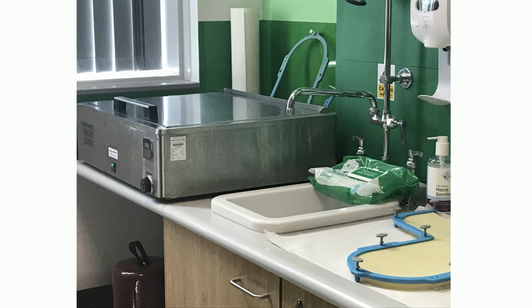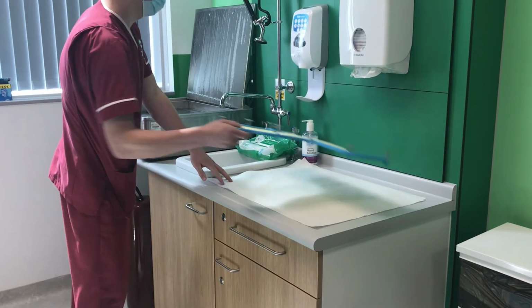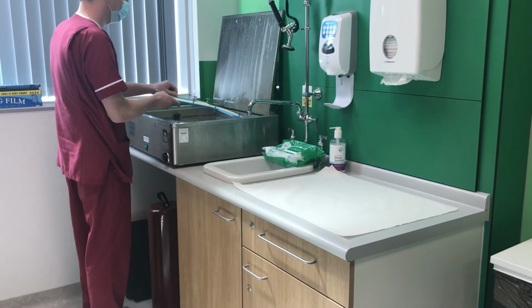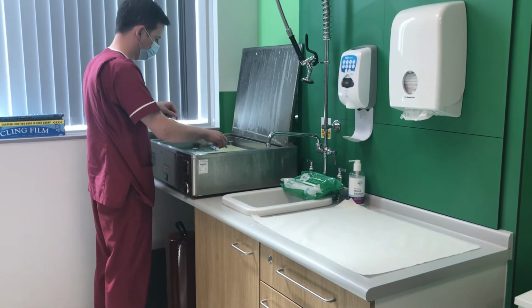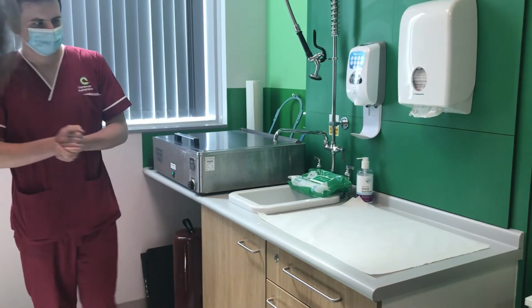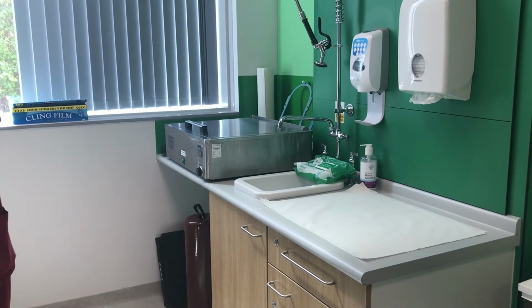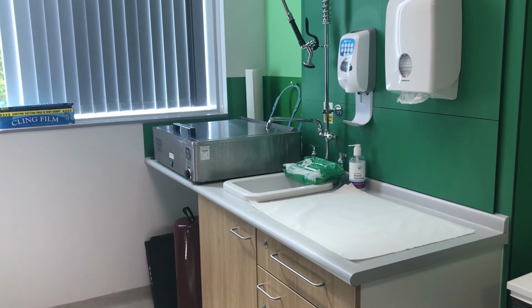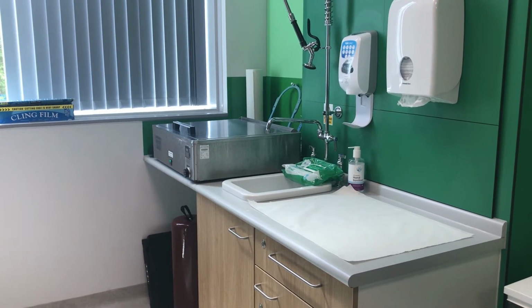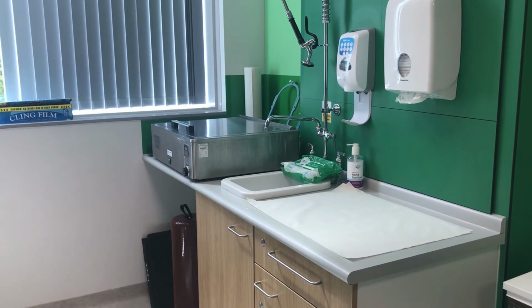When we bring it over, we'll let you know when it's coming, because obviously you won't be able to see. Just to make you aware, when it first goes on, it's flat packed, so it will squash the tip of your nose, but you can breathe fine. And we'll clip it all in and we'll alleviate the pressure on your nose as soon as we're clipped in. Throughout it all, we're going to ask you to make sure that you only communicate with us by using hand signals, because we don't want you to move your jaw once we get things underway, because otherwise it'll distort the shape of the mask. Okay.